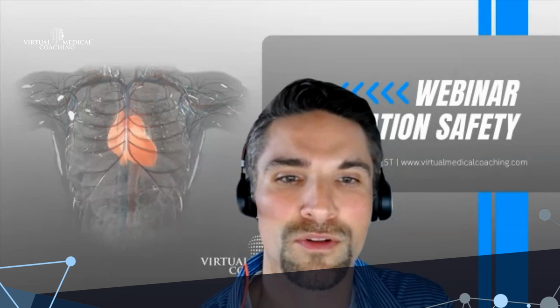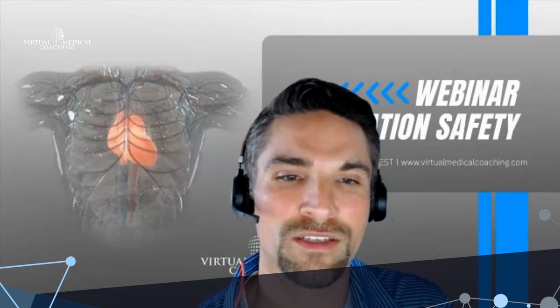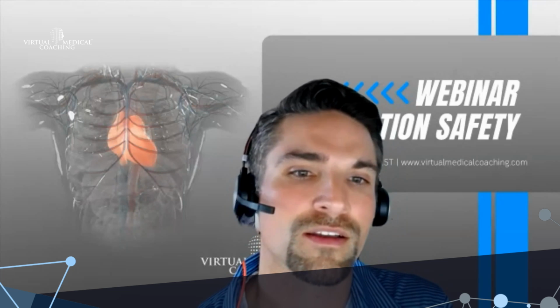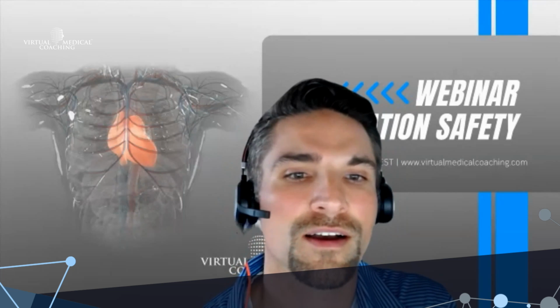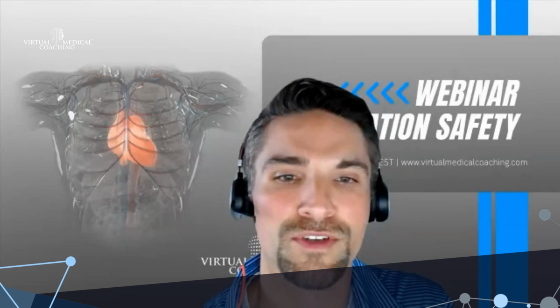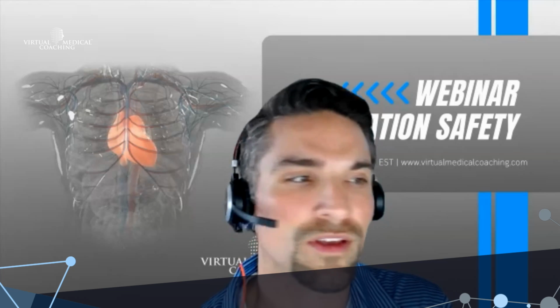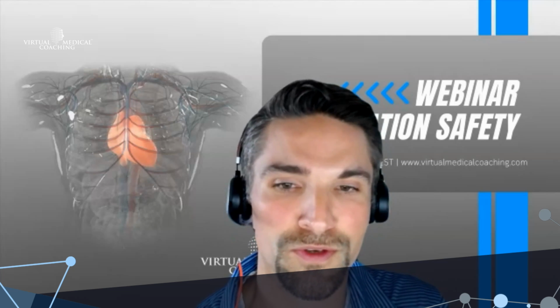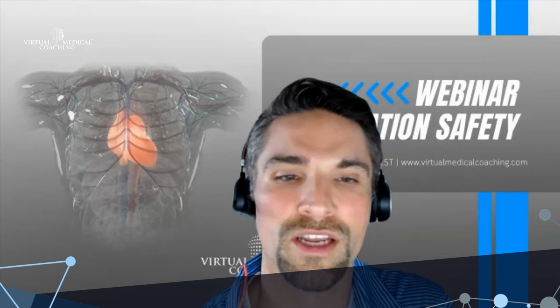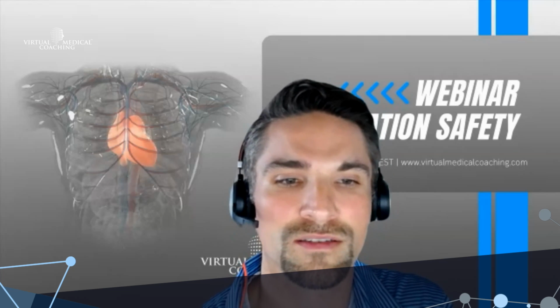Understanding these risks and utilizing that VR radiation safety training can teach everyone where the most sensitive body parts are, how the radiation is dispersed throughout that OR room, and where those green, yellow, orange, whatever color zones are designated for that specific radiation. It can really educate these individuals to stand back as far as you can, known as the inverse square law that Shauna was showing before. As you double your distance, you're going to have a quarter of the dose, because the intensity of the radiation is inversely proportional, meaning that as you stand farther back, there's going to be less radiation getting to you.